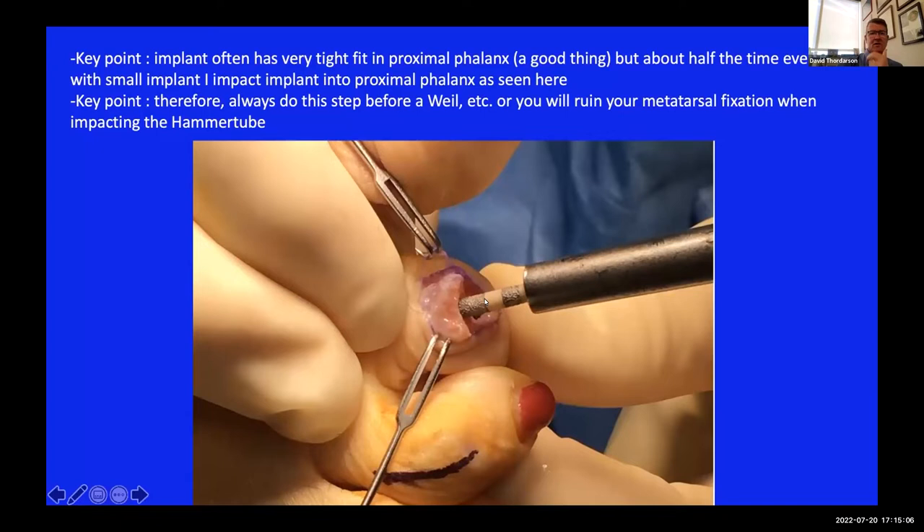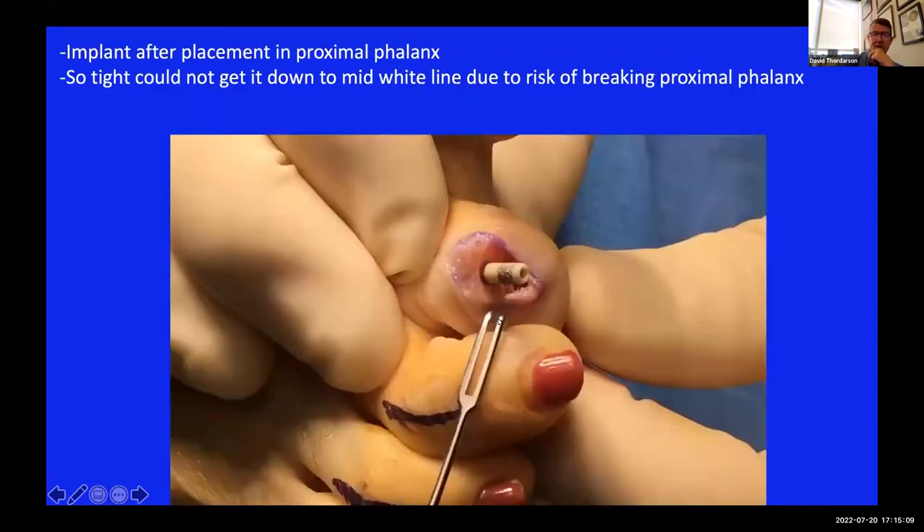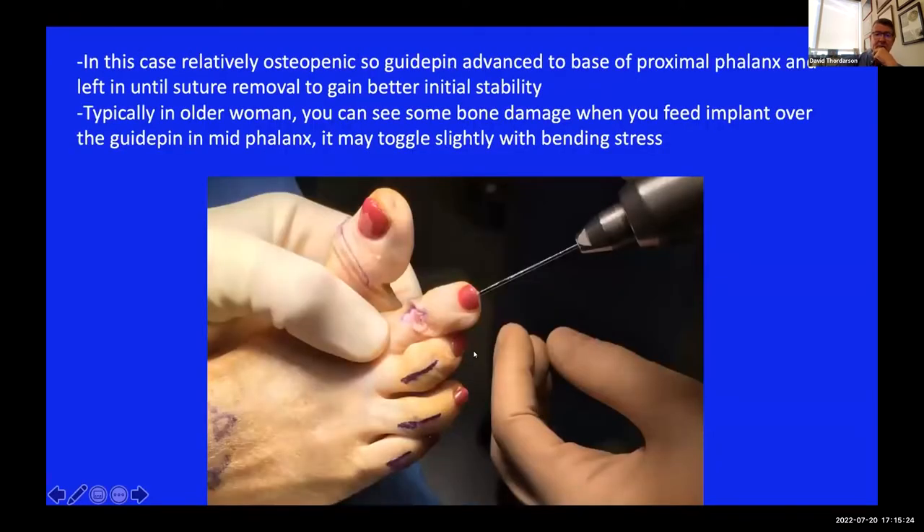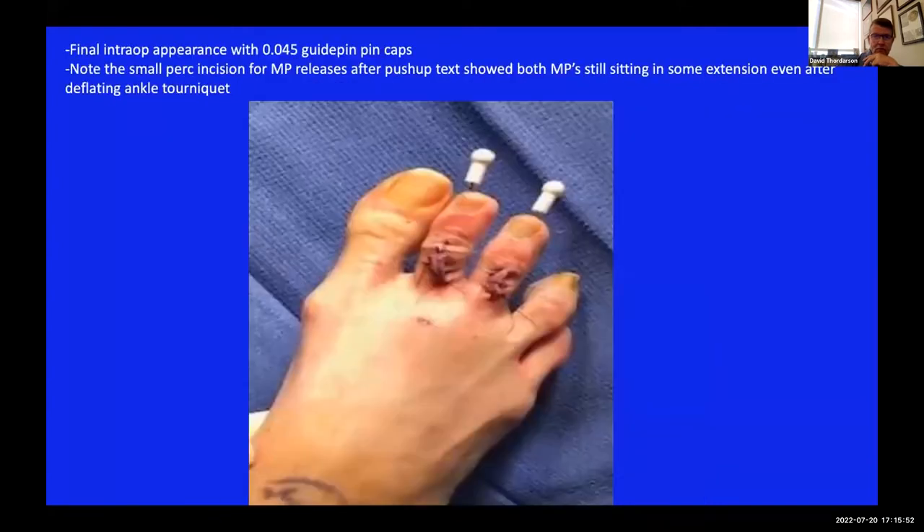If the proximal phalanx is in line with the metatarsal, you can gently tap the implant down until about half or a third of that peak is gone. Then you pull the proximal phalanx over and you'll see the tip of your guide pin just start to go down the hole in the implant - then you impact it. I typically always leave the pin in, even with hard bone, just in case they jam their toe or are non-compliant. That pin will keep it from displacing. The pin doesn't hurt at all when it comes out in clinic at two weeks, so I just recommend always doing that. These are 0.045 K-wire caps that you put on them.